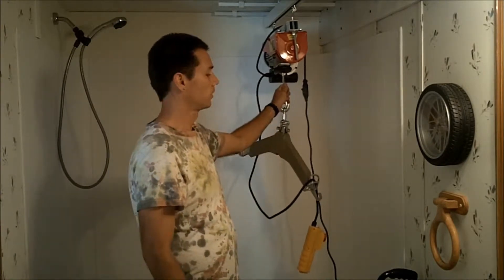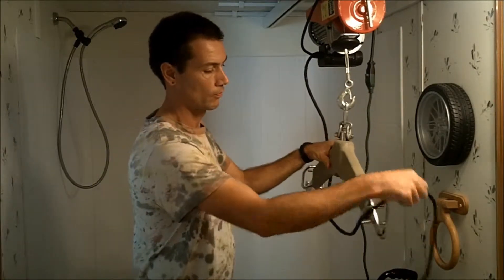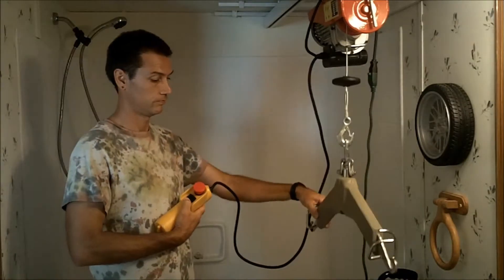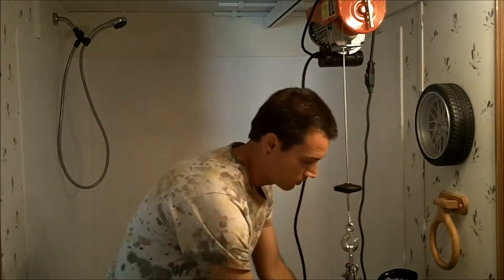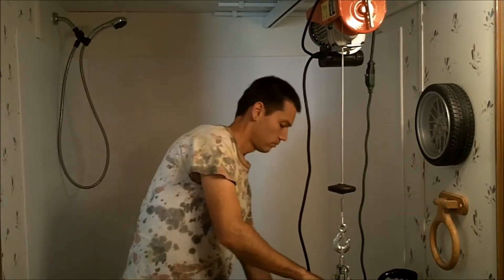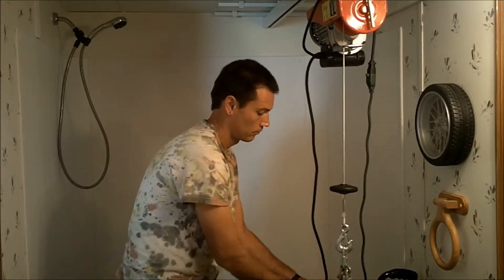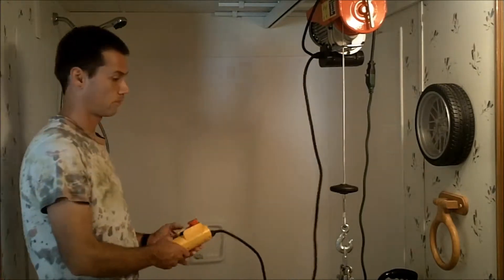Here we have the hoist with the Hoyer lift arm and the Hoyer sling on the chair. My son's sitting on the chair — I simply roll the hoist directly over him. I have the hand control here. It is a little noisy, but it does the job. Simple down button to lower the arm, then I attach the straps to the Hoyer lift arm — this is a six-point arm that I took off the manual Hoyer lift and attached to this hoist system. My son's now sitting in the sling. Up button to raise it.